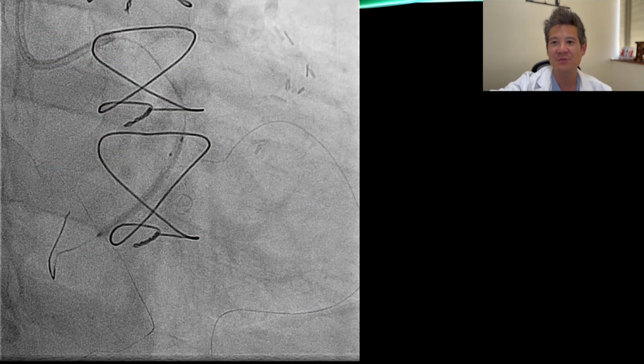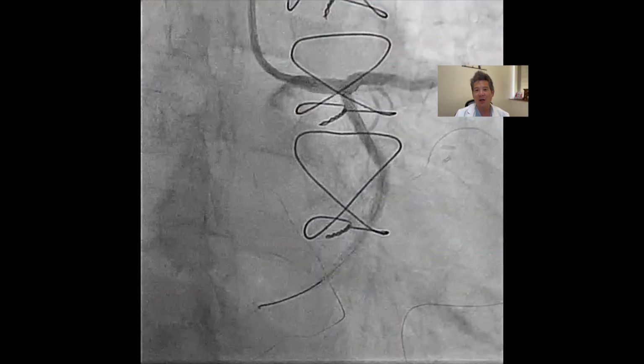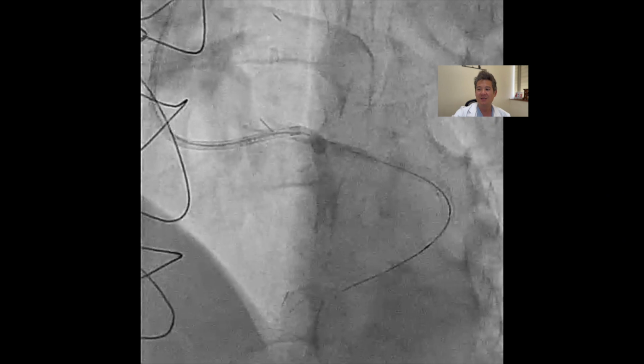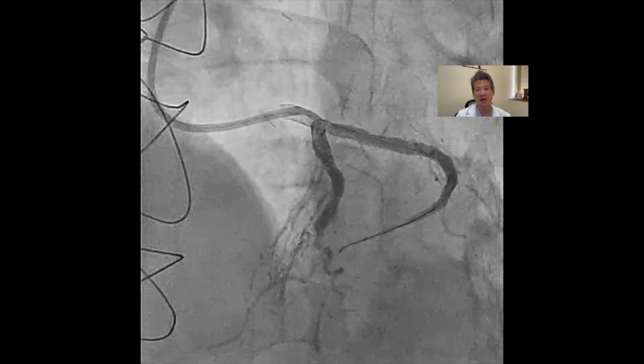And this is the first stent with the fine cross black dot there, second stent, and after I stent you can see a fantastic result because we pulled out all the hematoma, so none of the side branches were lost, and we've got true to true vessel lumen wiring. So at this point, we're about 2 hours into the procedure. I know the patient can tolerate around 3.5 hours on table because that's how much he tolerated last time.